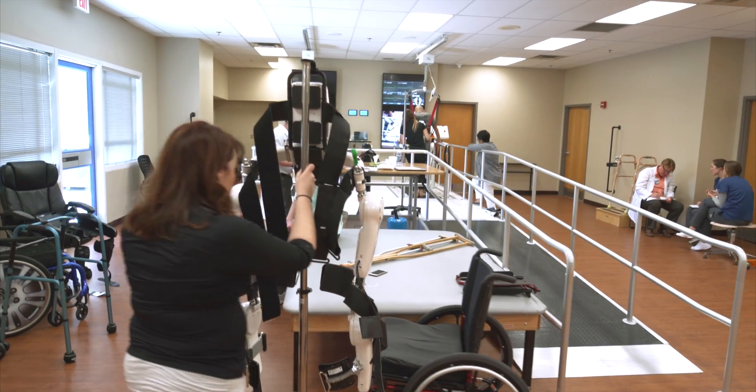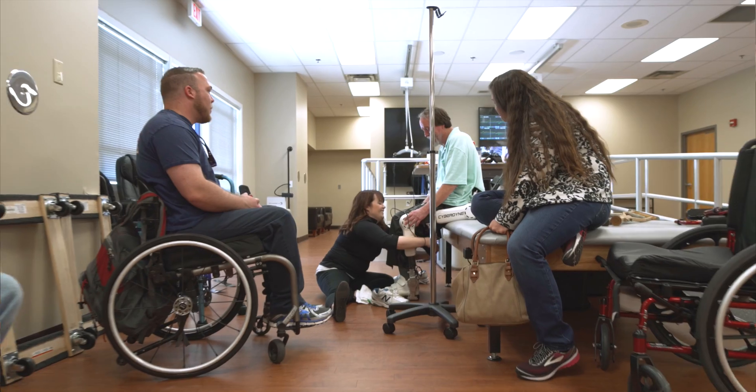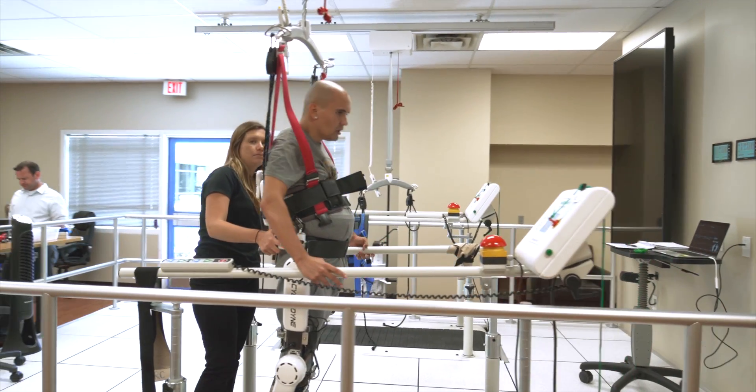It's been a whirlwind of a trip and a great learning experience for all of us at Brooks. We went and learned in Japan how to operate the robot, learned marketing strategies, and had to come up with the whole strategy to create our first international partnership in order to bring the HAL device and Cyberdyne to the United States and to Brooks itself. The patients that have gone through it so far have had great results — including many results we didn't expect to see — and we look forward to seeing many more patients progress toward their functional goals.